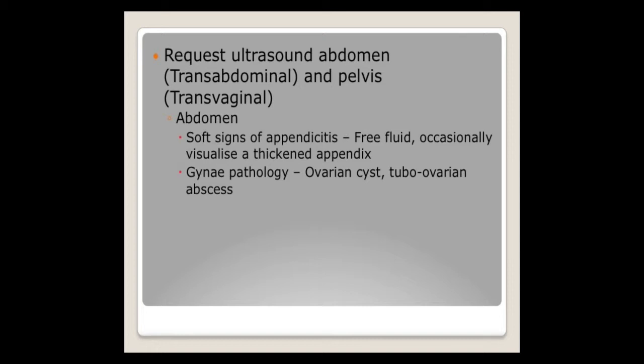In this instance, it may be entirely appropriate to request both a transabdominal ultrasound scan of the abdomen and a transvaginal ultrasound scan of the pelvis.